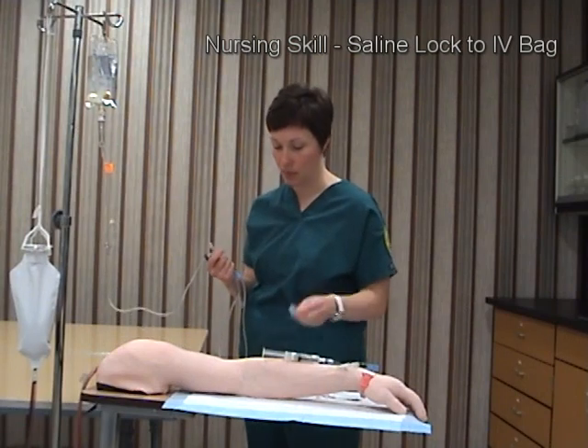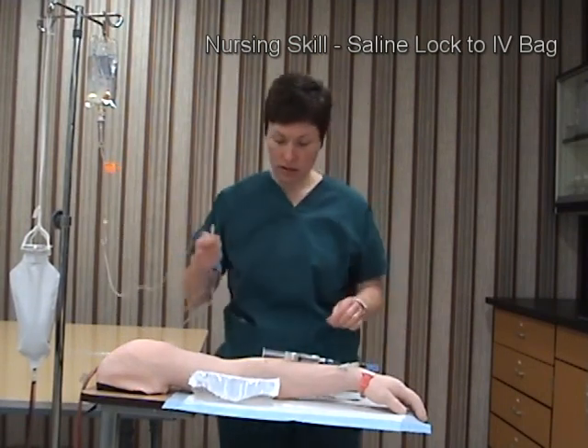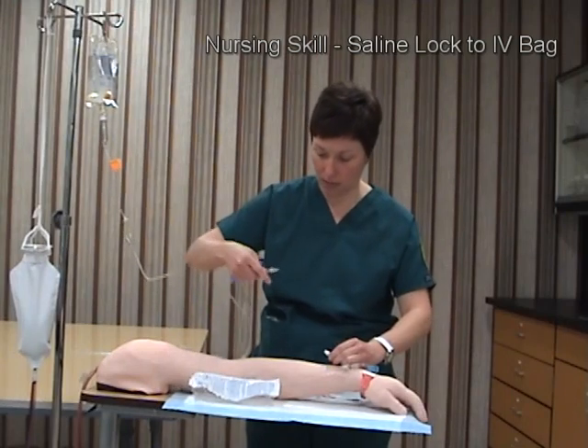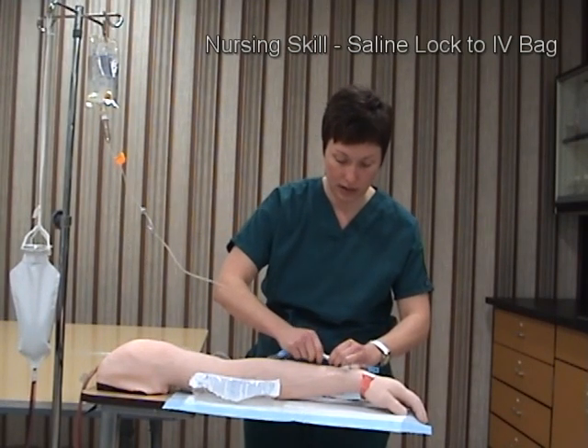I can replace the cap, but since I've just had it in my hand I know it's sterile and clean. I'm going to disconnect the flush from the saline port and aseptically connect the two ports together.